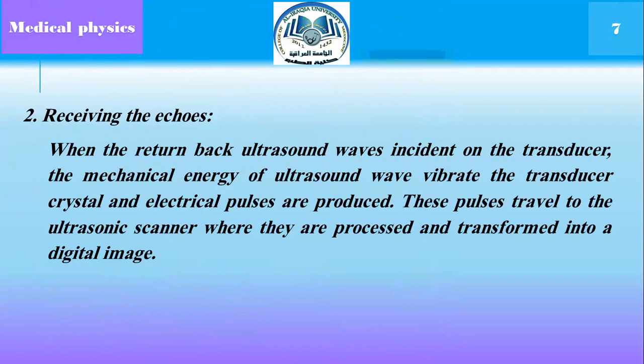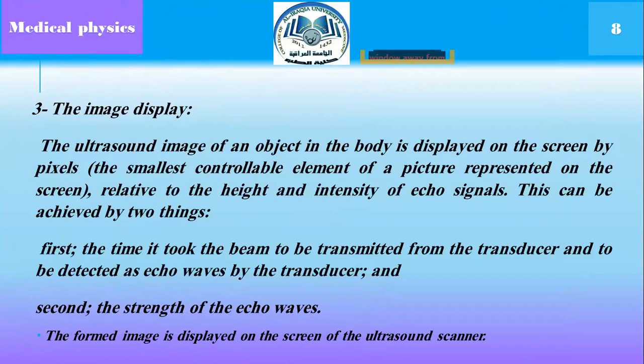3. The image display. The ultrasound image of an object in the body is displayed on the screen by pixels relative to the height and intensity of signals.